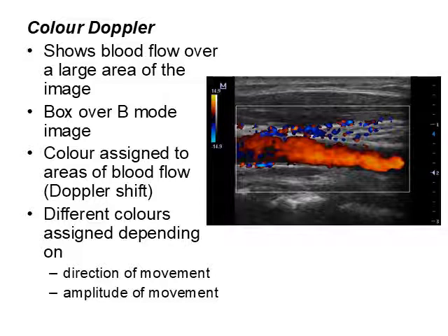So if we look at our vessel here, what we'll notice is it's quite red, so the blood is moving slower on the outside, and then it's nearly to yellow in the centre, so the blood is moving faster in the middle. Now that is what we expect to see, because the walls of the blood vessel provide resistance to the red blood cells' movement, and that will slow them down. So we expect those in the centre to move faster than the red blood cells on the outside that are getting a bit squashed and a bit caught up on the walls of the vessel.